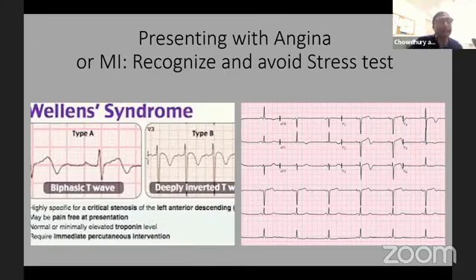But remember, in LVH, sometimes when they go on the treadmill, the double product, meaning systolic blood pressure times heart rate, goes high, there is demand supply mismatch. You may see some T wave changes, not necessarily meaning high grade stenosis, a false positive treadmill.